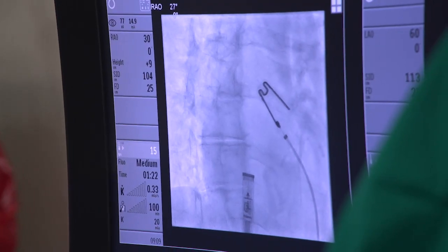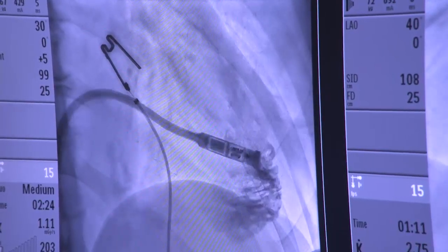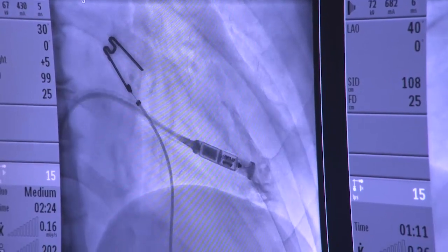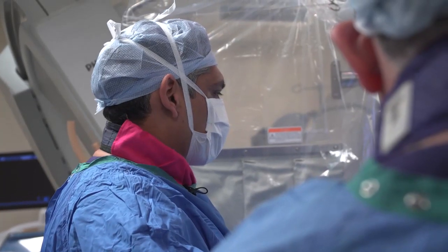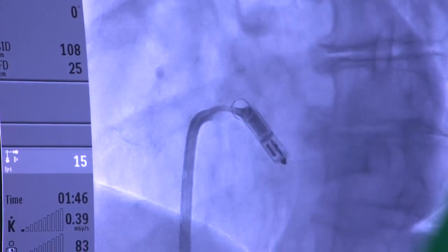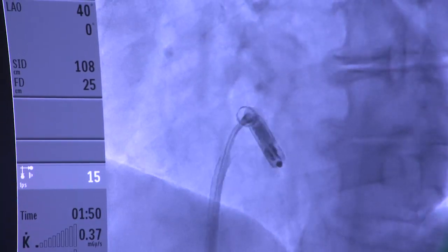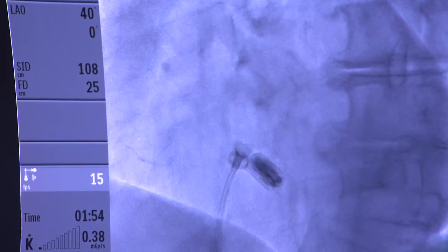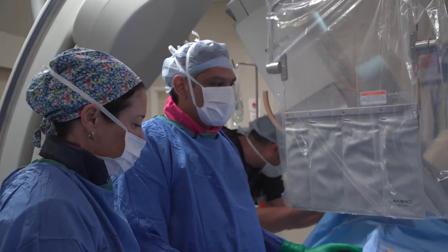Right. Do you like a slightly lower approach? Which is, in fact, where that is. Yeah, absolutely. Okay, just pulling back a little bit and then all the way. Okay, and we're going to come back just a little bit now to free the housing from the device. Something like that. Okay, nice and still.